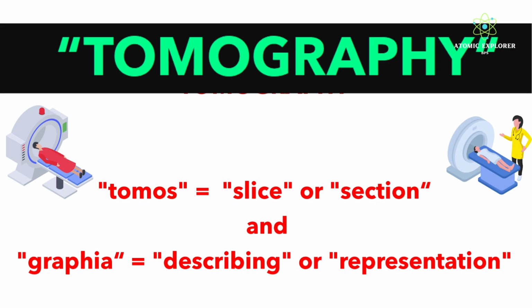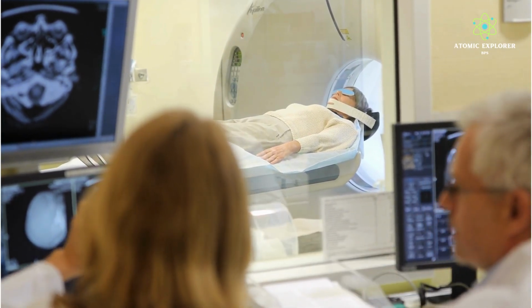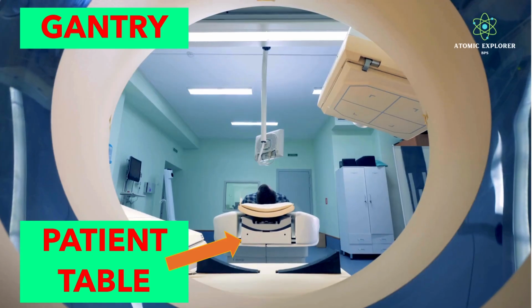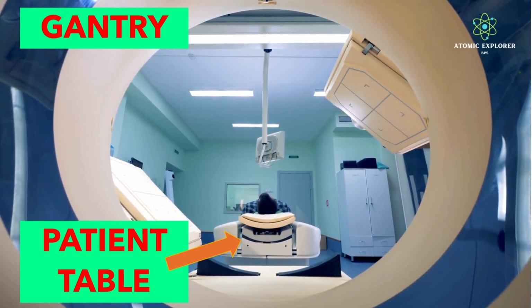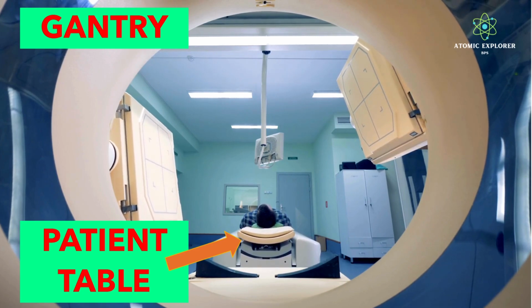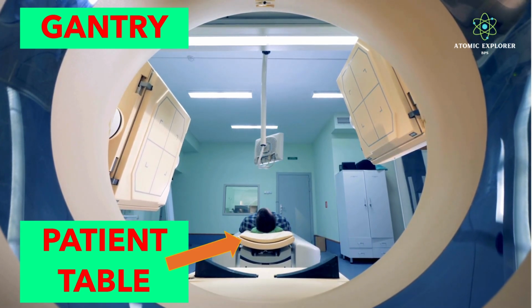representation. As we look at this diagram of a PET scanner, let us identify the key components that make this advanced imaging technique possible. Here you can see the gantry, which is the large circular part of the machine. This gantry houses the detectors, which form a complete ring around the patient table.